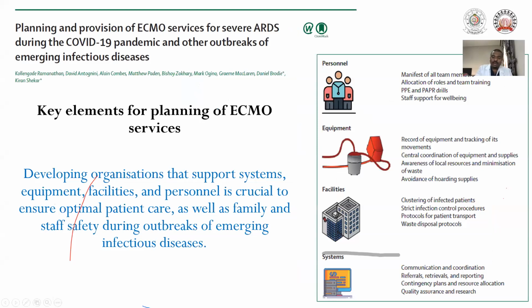And recent publications have come out. If you want to develop an ECMO program in COVID-19 situations, remember these key elements. Developing organizations that support the systems is the most important requirement. You need to have enough equipment, facilities, and personnel, which is crucial to ensure optimal patient care, as well as family and staff safety during outbreaks of emerging infectious disease. This article has given extensive guidelines for how to arrange things for the current pandemic. So I want all of you to go through this particular article.